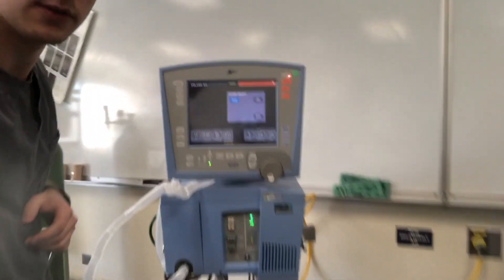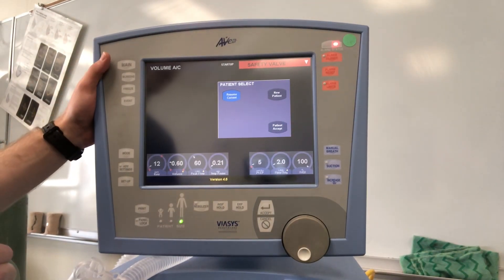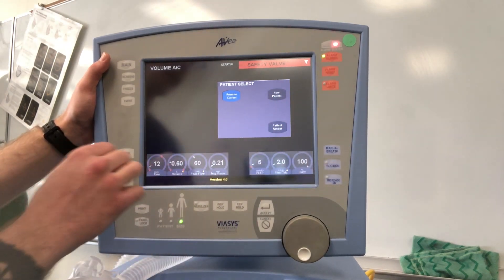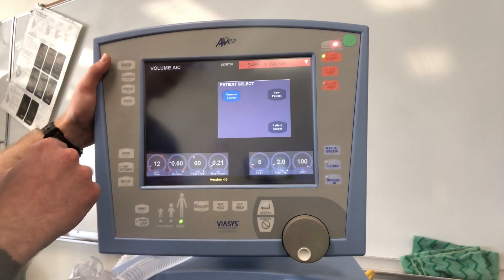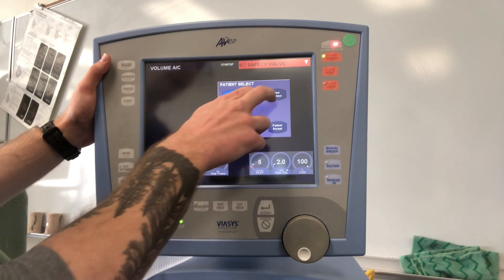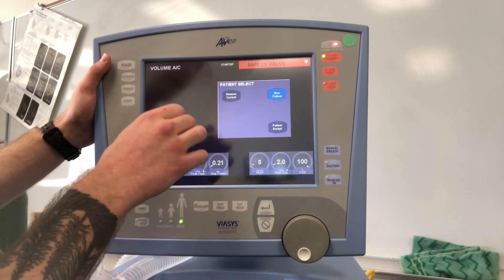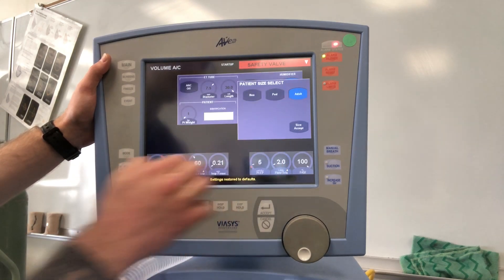On the screen we have a couple of options. We have 'Resume Current Patient,' which will jump you back into previous settings — useful if you recently turned off the ventilator or want to save settings from a previous setup. We're going to select 'New Patient,' pretending this is a brand new patient, then hit patient accept.